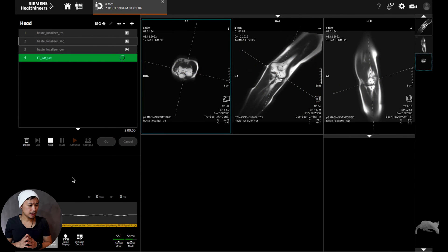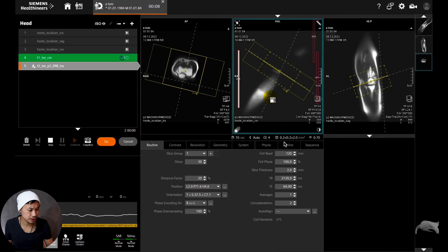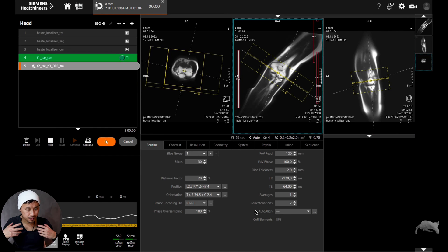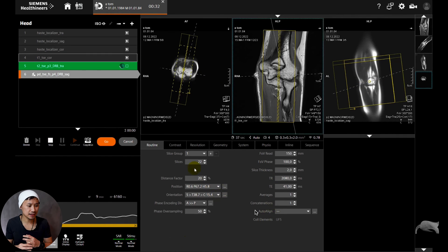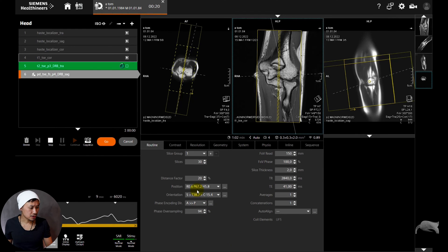Getting back to the elbows: I did three sequences — T1 coronal, T2 transversal (also with Deep Resolve Boost, 55 seconds, resolution 0.2 by 0.2 mm), and a PD fat sat sagittal. Having Deep Resolve or AI available speeds up the examination so the patient lies in the scanner for less time and you still get good images. We're going to compare all these images head to head.